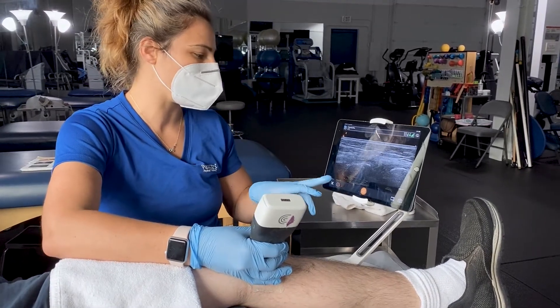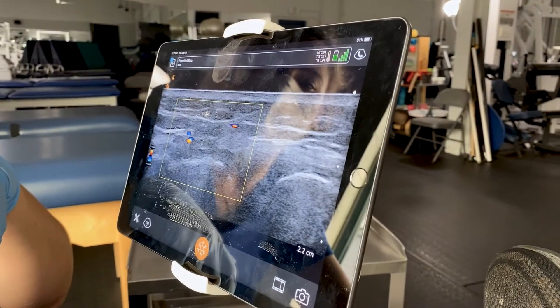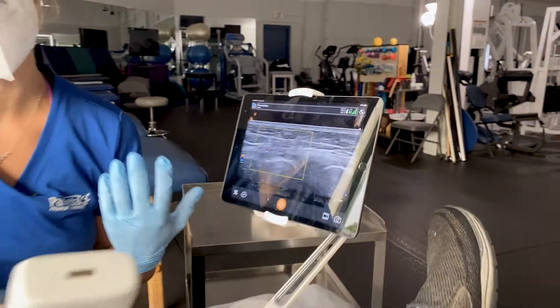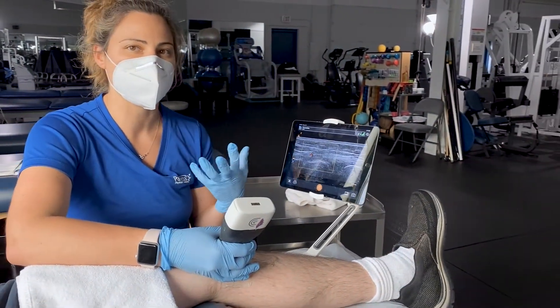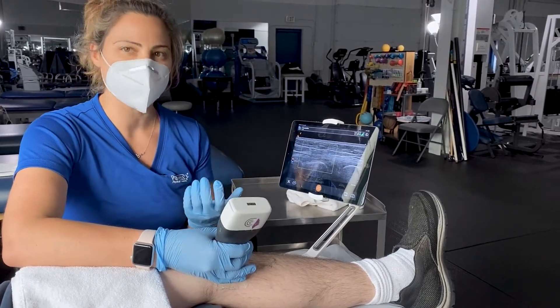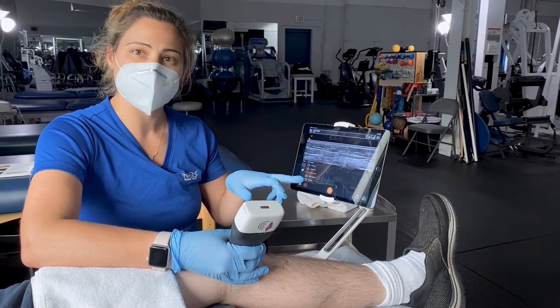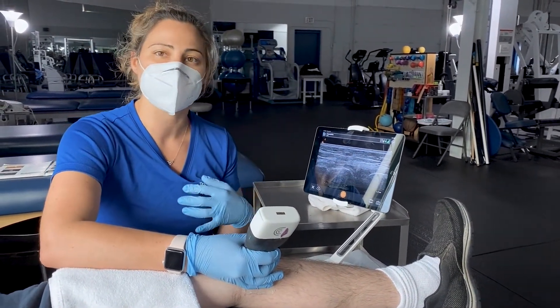We can also look at color, so we can see blood flow to the area. Sometimes if you have tendon pathology — which is just a fancy word for saying there's something wrong with the muscle or the muscle as it attaches into the bone — you might see increased blood flow. So we do like to use color Doppler imaging in our exam when we suspect that type of thing could be going on.